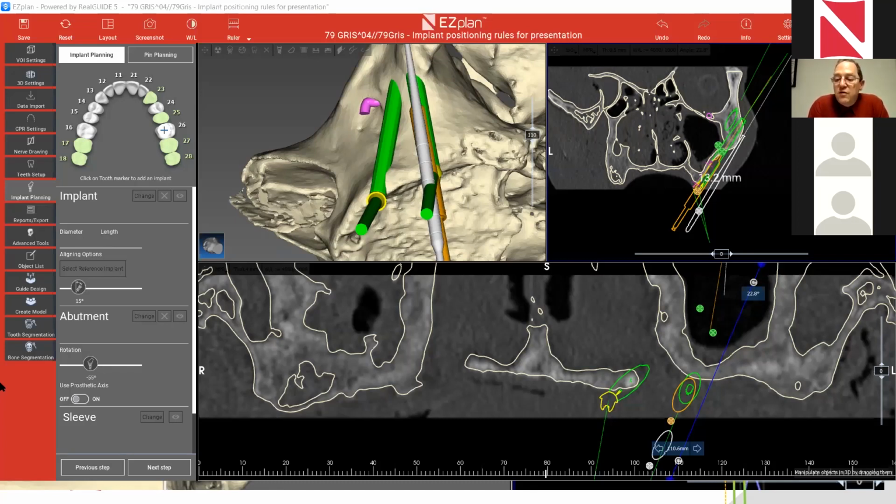You might have some oral fistula that you have to cover because of the damage to the bone itself. One of the ways to do that is with buccal fat. You could have a resorption of tissue with time, but the implant is not threaded and not surface treated, it's machined.